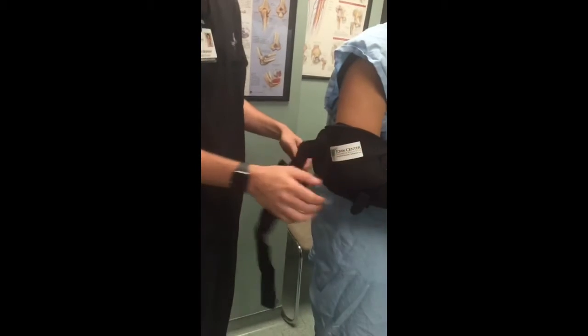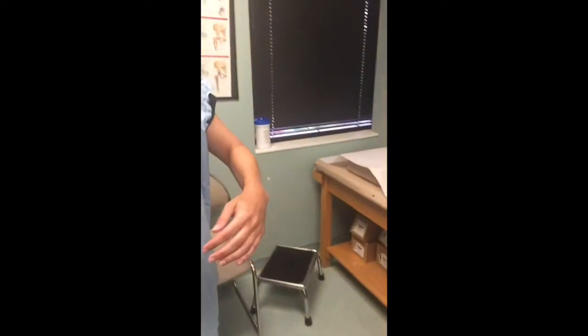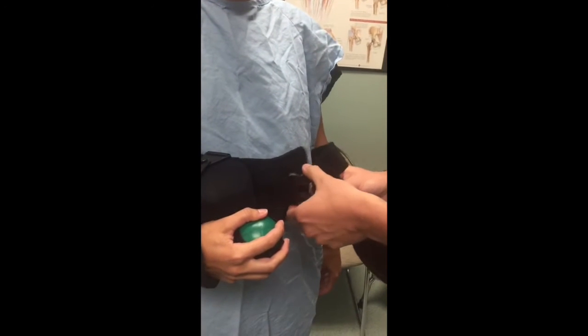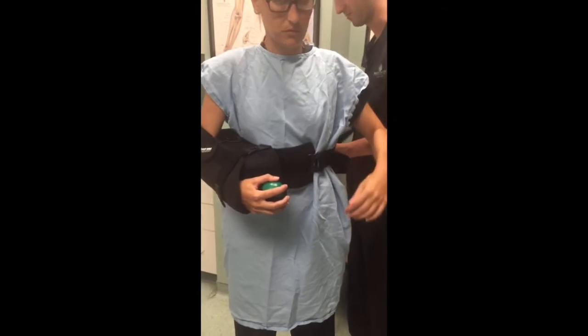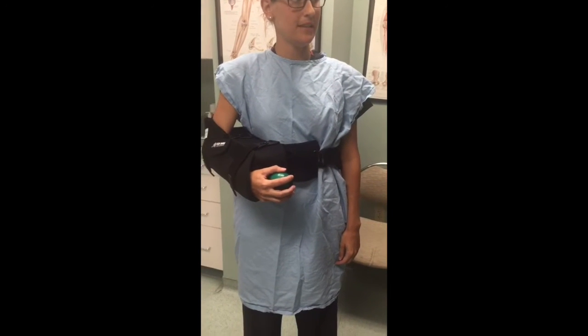The last strap we have is a strap that goes around the patient's back, which we'll take around over here, and it clips into the front of the sling here. After it's clipped in, you can pull this tight so that it fits securely around the patient's waist and provides them some support. And again, we'll also Velcro on the side of the strap here. This is all the patient needs. They do not need any shoulder strap or sling.